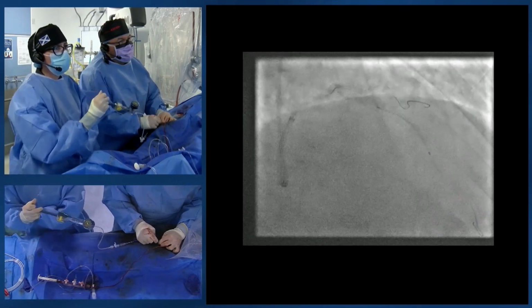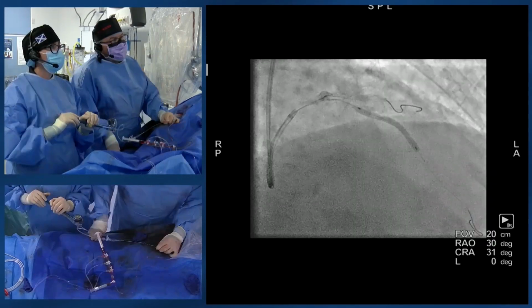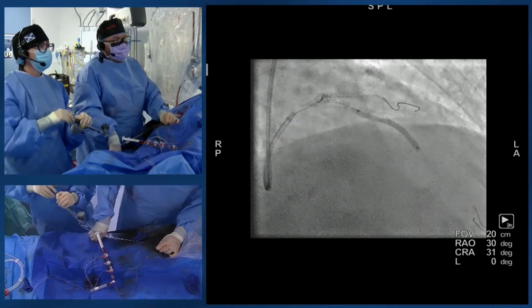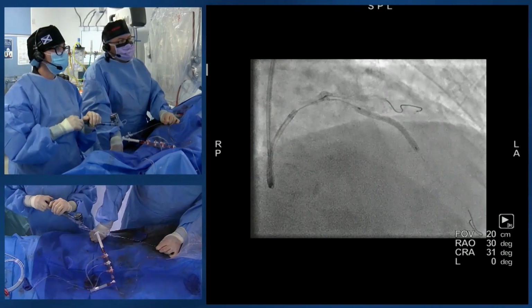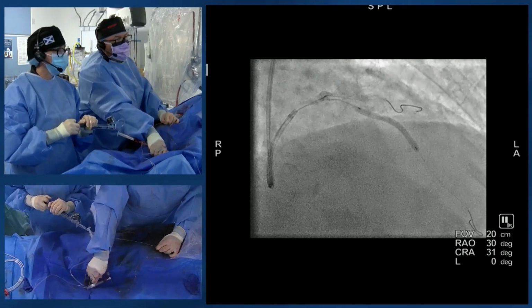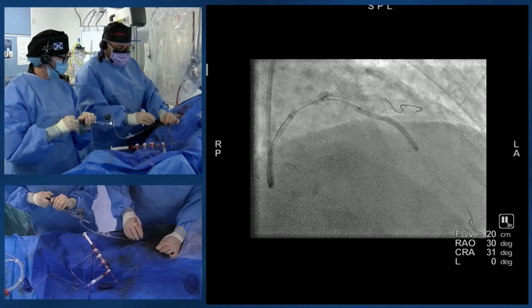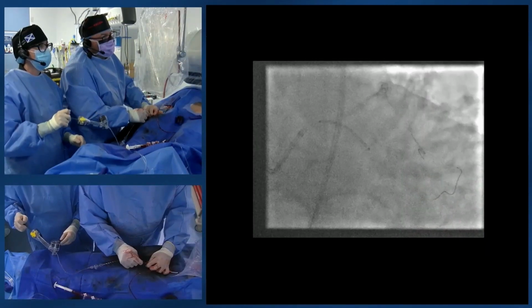Wow. Okay, so we picked our angiographic landing zone as that septal perforator, Stuart, didn't we? That's good. Very slight constraint just in that area, but nothing that we won't be able to deal with, I think, with non-compliance. I'm deliberately only at 12 atmospheres for the distal edge. So what Stuart will do now is just creep the balloon back a bit, and I'll give it a bit higher. So this will give us an opportunity to use stent viz.